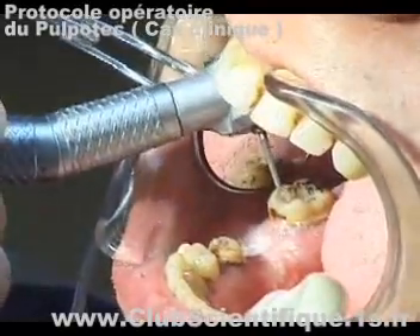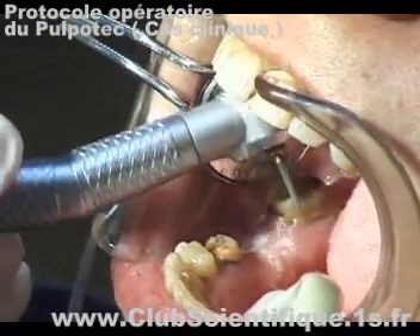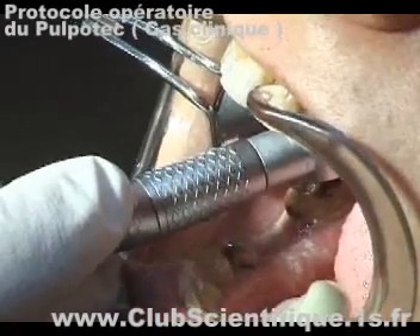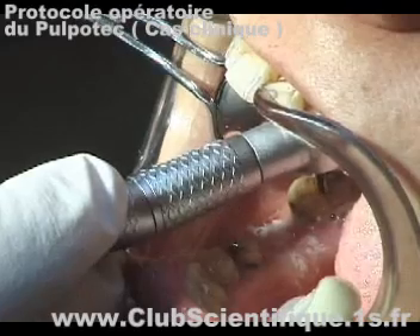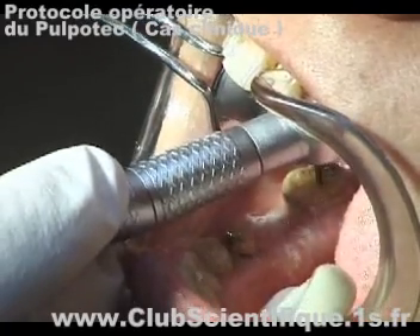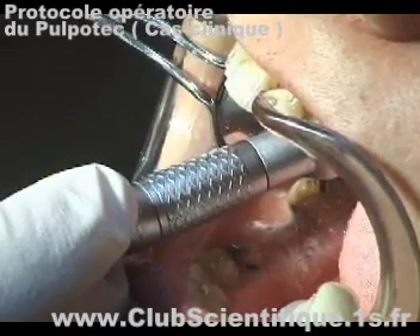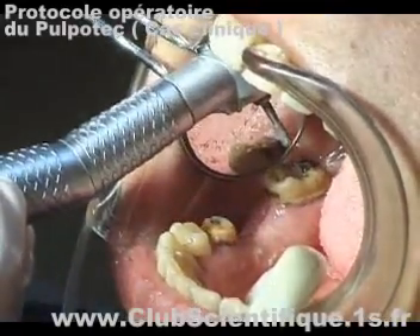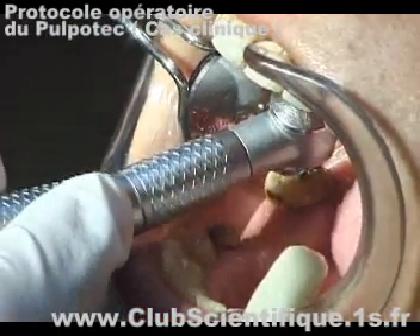The excision of the vital pulp is performed with a tungsten carbide endo burr, and once the pulp chamber has been shaped with a pear-shaped diamond burr, the procedure continues.